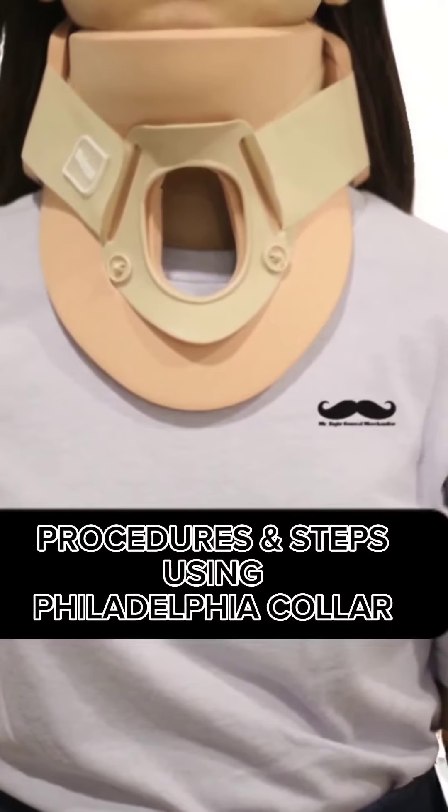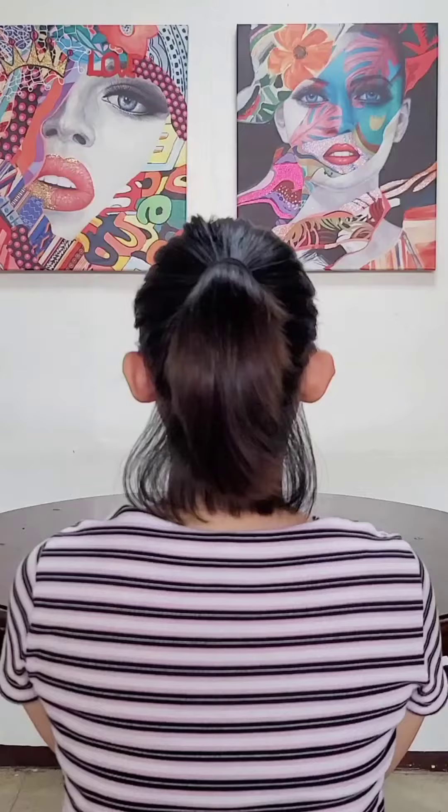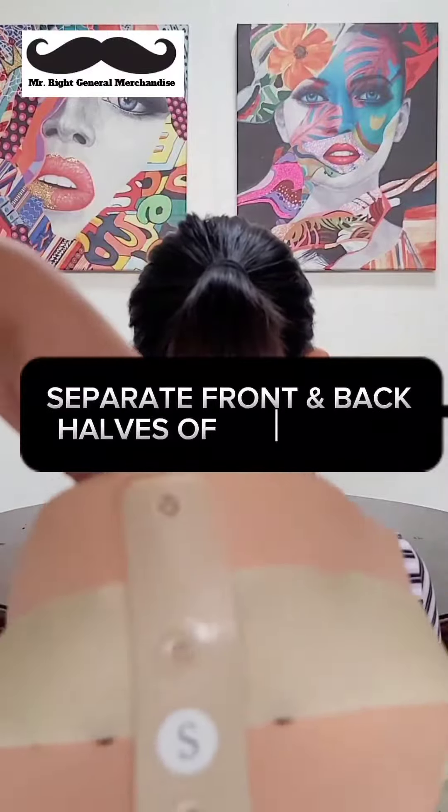Procedures and steps using Philadelphia Collar. Separate the front and back halves of the collar.